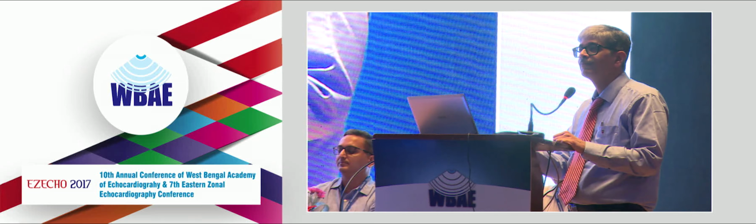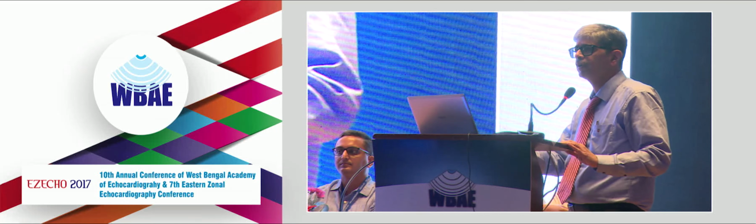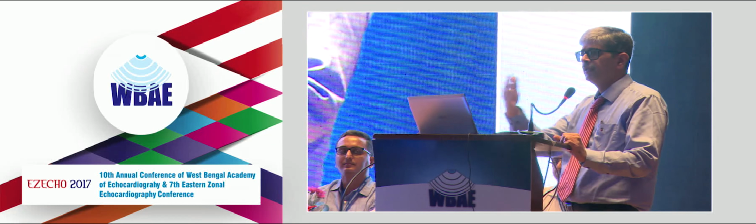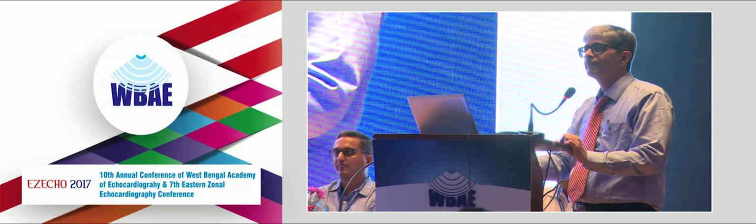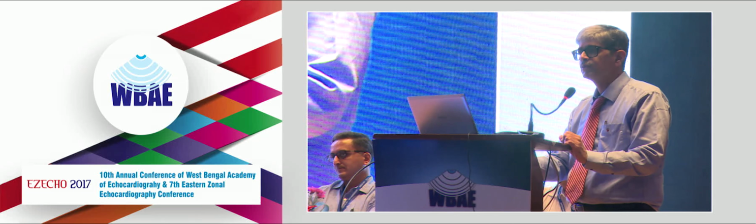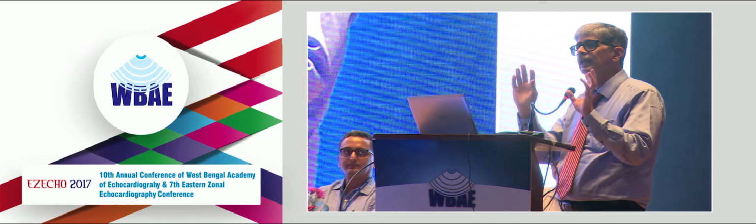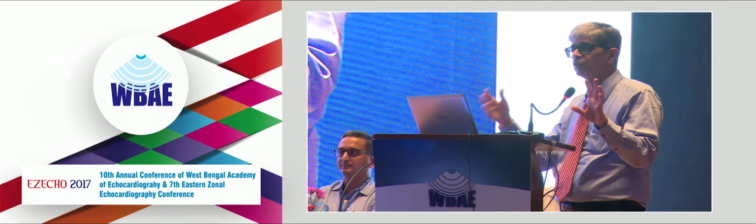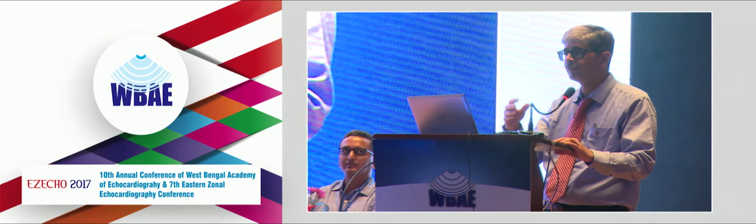Will that only be seen in the pulmonary artery or in the other part? No, in RVOT you will see the coronary fistula post-operatively because they've resected so much muscle. There is no history of operation, but still some flows are there in the pulmonary artery below the pulmonary valve, and hopefully they are arising from the left coronary artery. So would you call it a coronary artery fistula? In congenital heart disease, you can see any combination. You have to be ready for it. Definitely, we'd like to look at the images if you have some after the session.